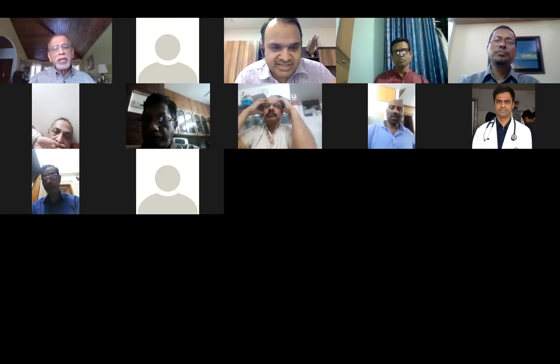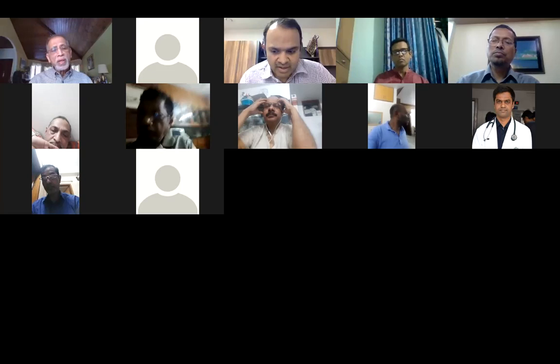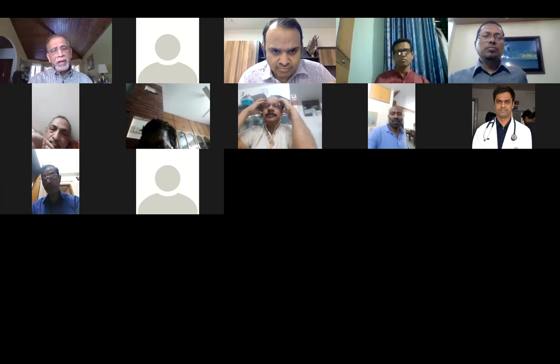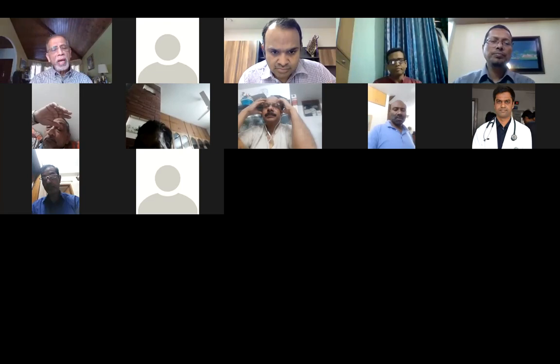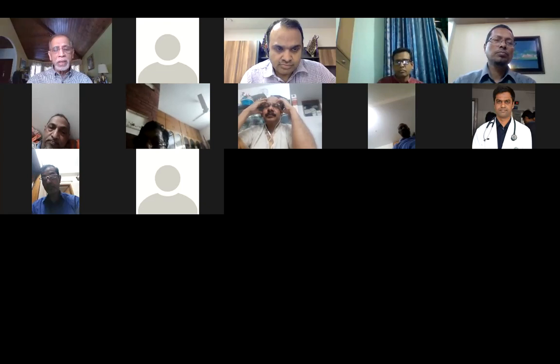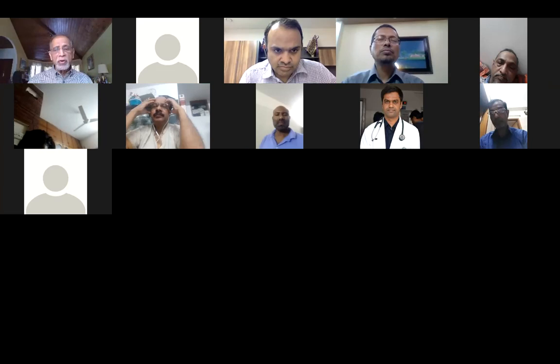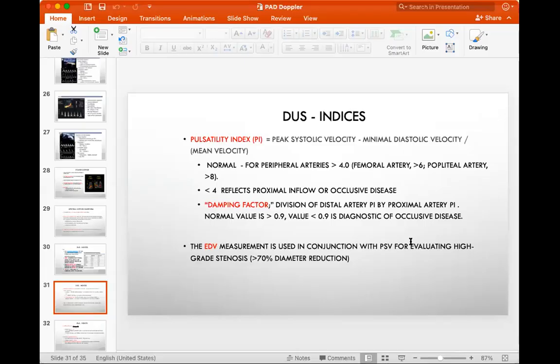There is a study which followed people who had an RI of 80% or more. At least 50% of them ended up having renal failure. This also becomes important when you are planning interventions for renal artery stenosis. Are they going to respond to the interventions for control of hypertension? People who have a high RI as well as a significant hemodynamic stenosis of the renal artery do not necessarily all respond to interventions for control of hypertension. So you really need to look at the RI before you do the intervention.